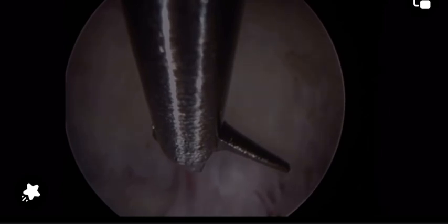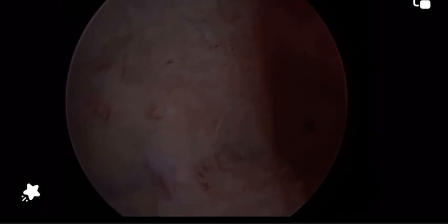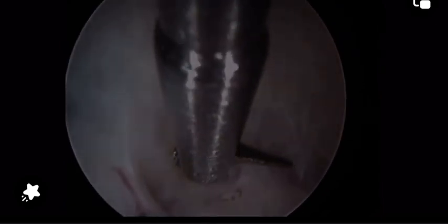Move from side to side, rotate to look at the cornua, and always remember that the tubal ostium is your GPS point. So every now and then you find me rotating the lens to look at the tubal ostium to check my position and keep on the same line. The objective of surgery is to finish when both tubal ostia are at the same level, at the same line.